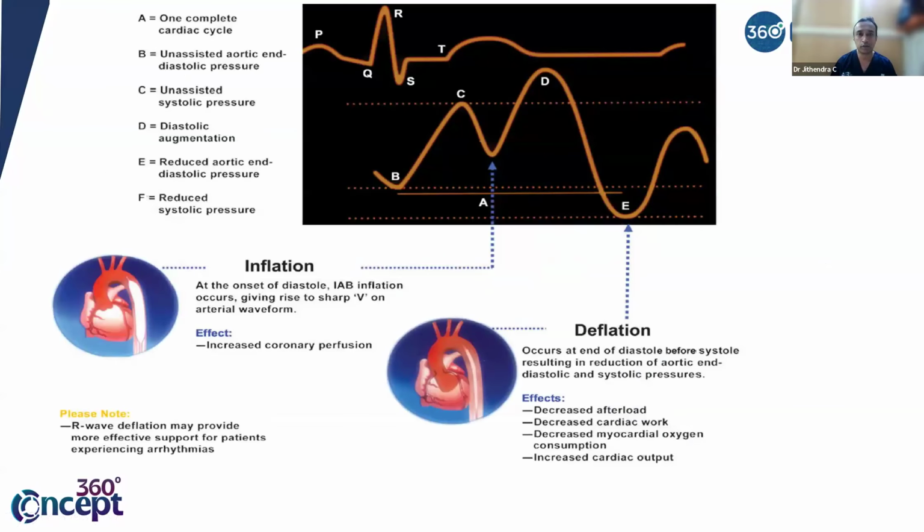So what all are you seeing? The top one is your ECG. Usually the commonly used trigger is your ECG. So usually we time it, I mean, you set a trigger. We will see what a trigger is. The trigger is what is initiating an inflation and a deflation. Okay, what is initiating an inflation is a trigger. The commonly set trigger is your ECG waveform.